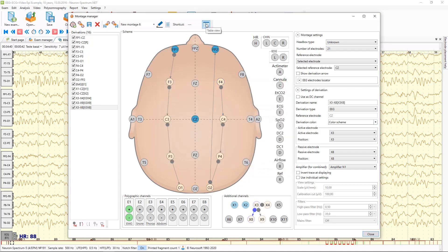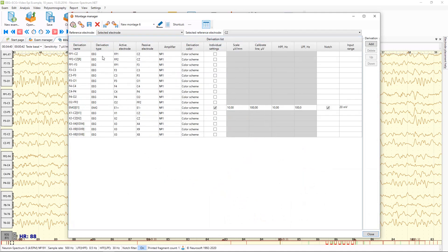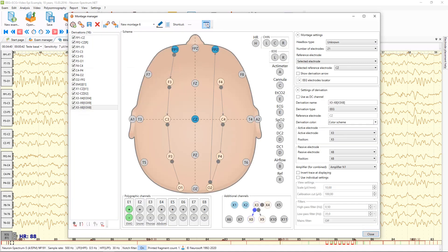Also here you can see the tab view of the montage, where you can see the list of derivations. You can set up all of them using these columns — for example, you can set up filters, scales, and so on.